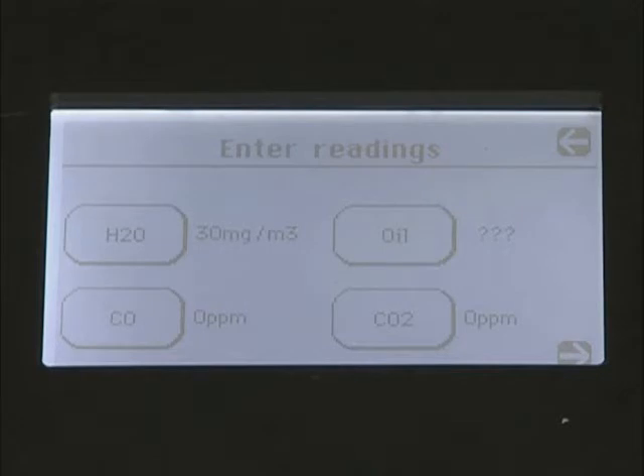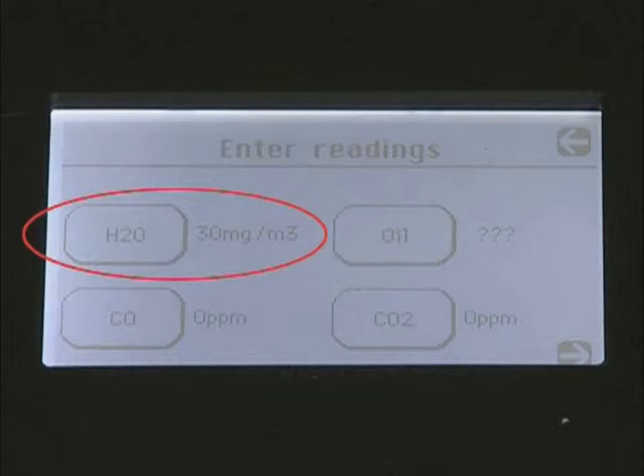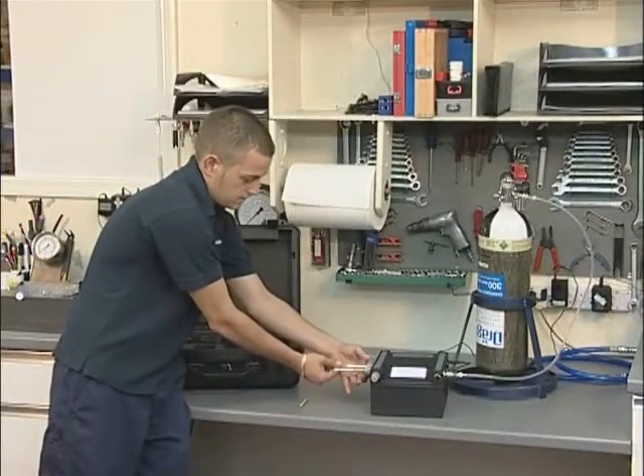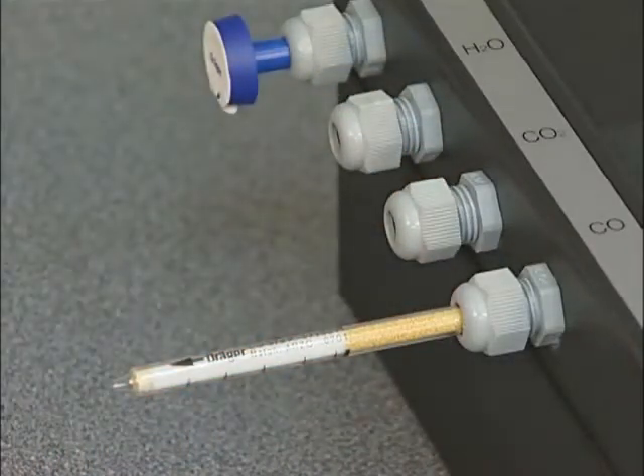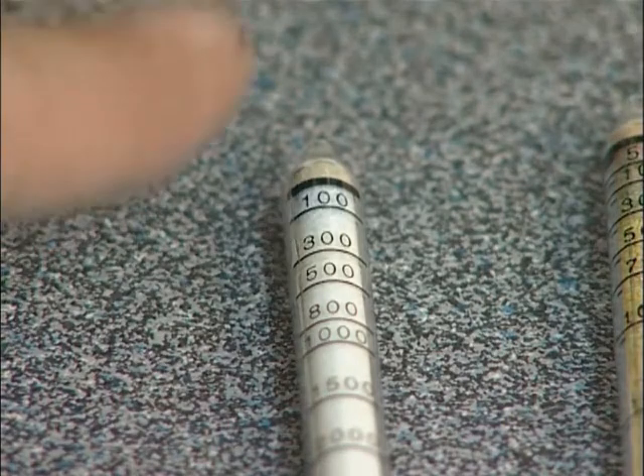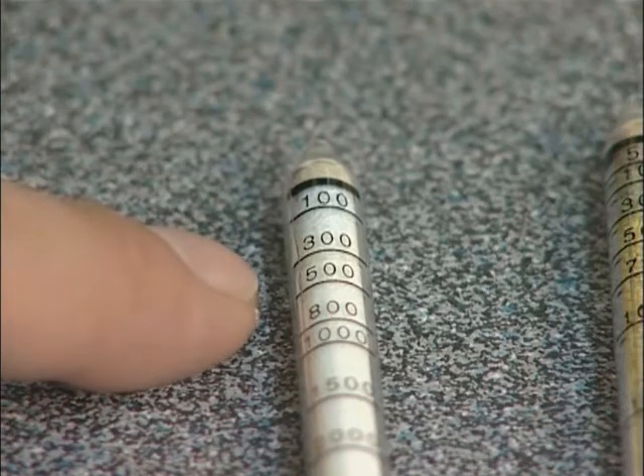For the F4001ED, the water content has already been automatically recorded, so this button is not featured. A maximum carbon dioxide level of 500 ppm is permissible in breathing air. The expected background level is approximately 380 ppm.